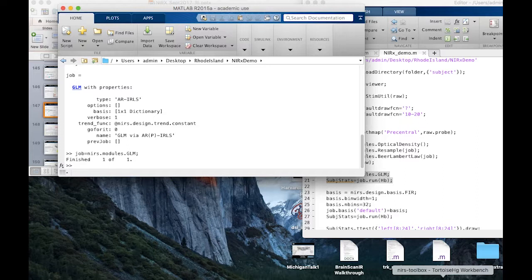If you don't do that, and I don't want to knock anyone who's currently doing NIRS research, but say you're using Homer code, which doesn't account for this kind of stuff, Homer can tell you, oh, show me the results at 0.05 stats. Depending on how bad your data is, it can be 60 to 80% false discovery, which means that you're reporting on results that probably weren't correct. It's because the statistical test you did was not valid for that kind of data. So that's what we work on.